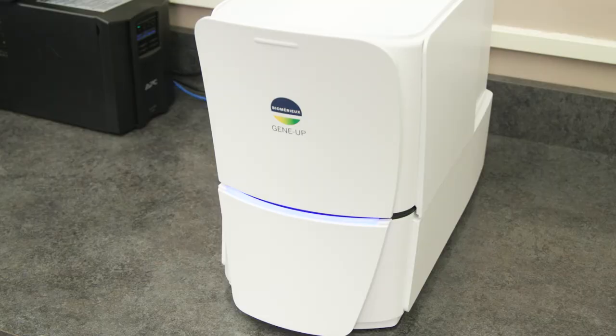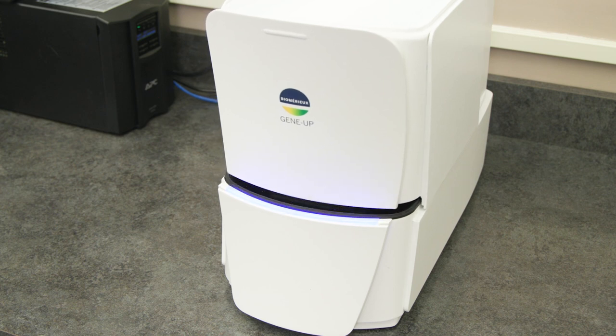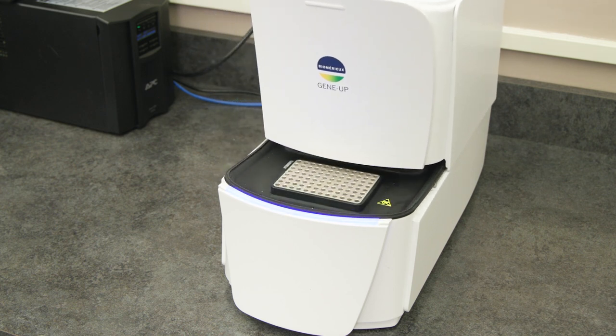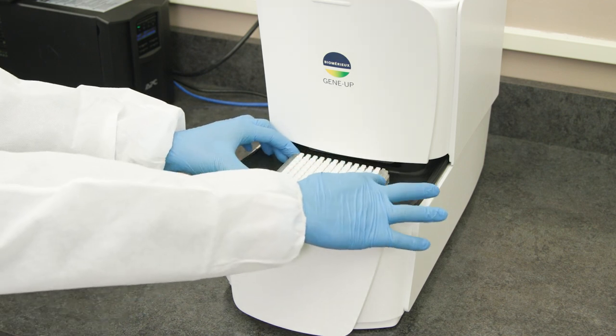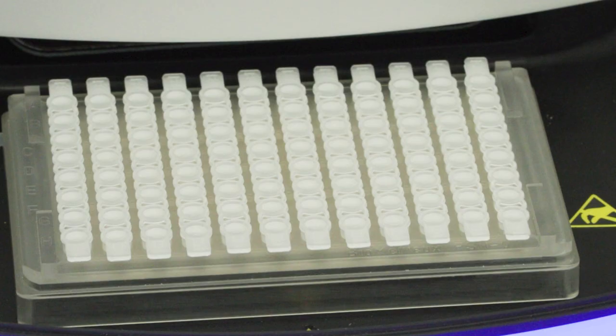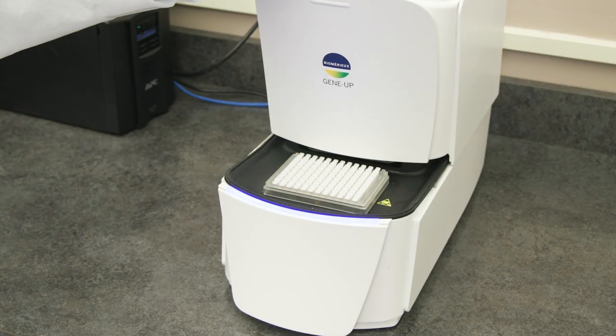Step 2. Running the daily self-test on the open software. Open the GeneUp instrument by pressing on the top panel. Insert the prepared self-test PCR plate holder with the strips and the caps onto the electroform heating block. Pull the door to close.